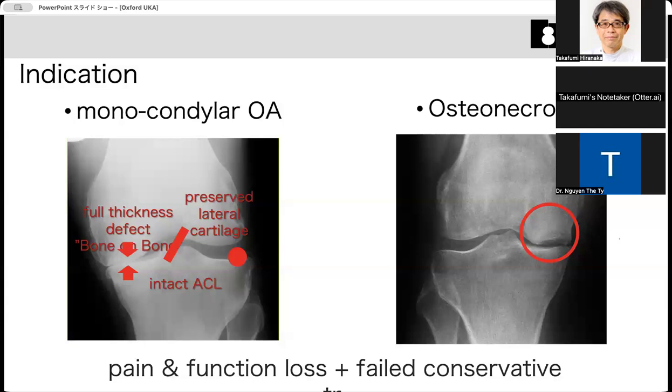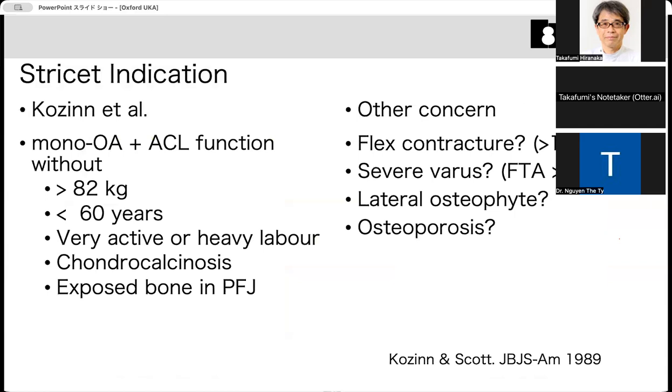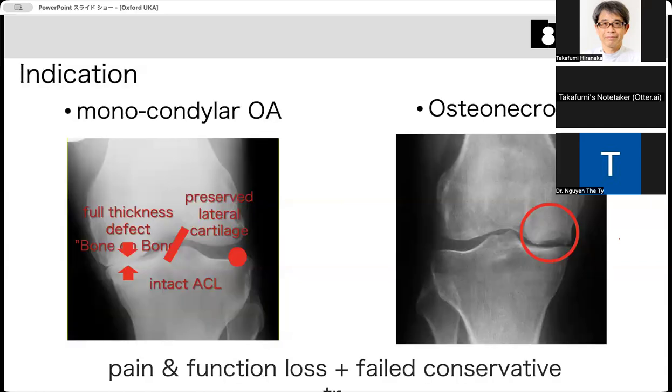これを治すんじゃなくて、要するに痛みを取るために手術をするんです。でないと、こんなん見ただけで手術を勧める先生もおるんですよ。それを避けましょうという。This is the fundamental mobile bearing indication.